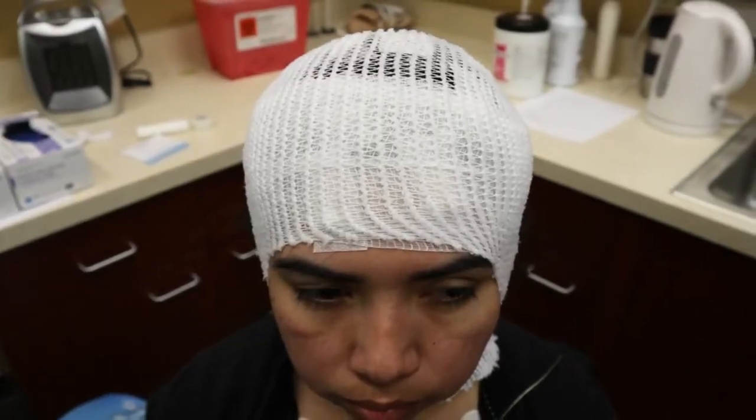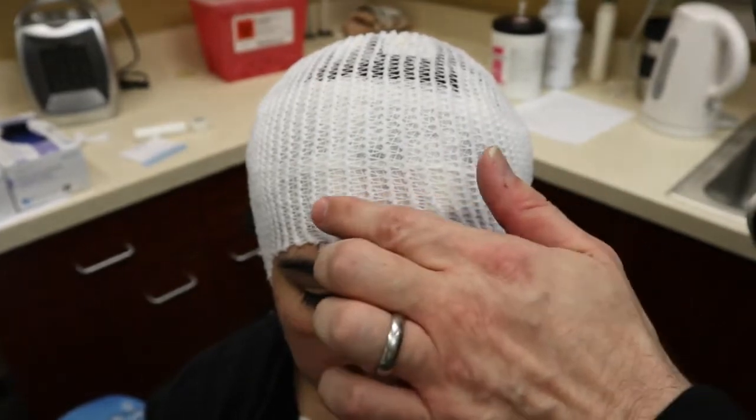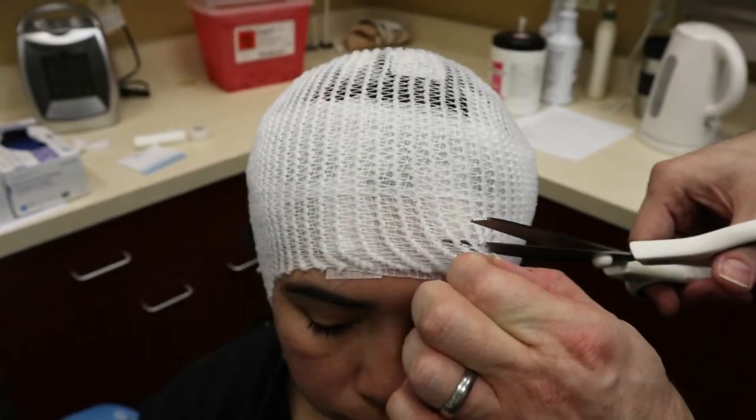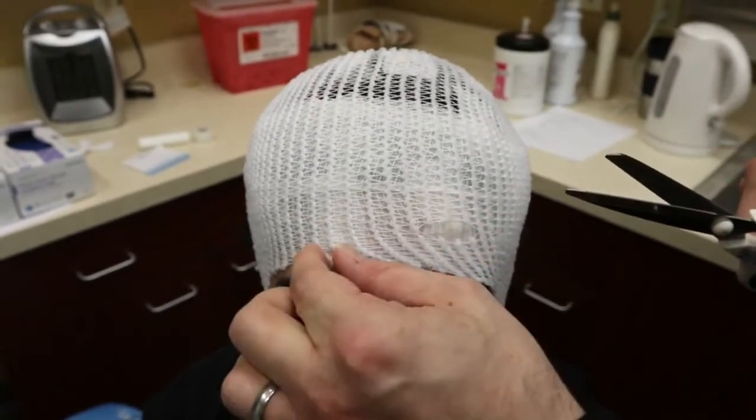Finally, I'm going to make a couple of relief cuts over FP1 and FP2. That's just to prevent any skin breakage from there being too much pressure right over the electrode.